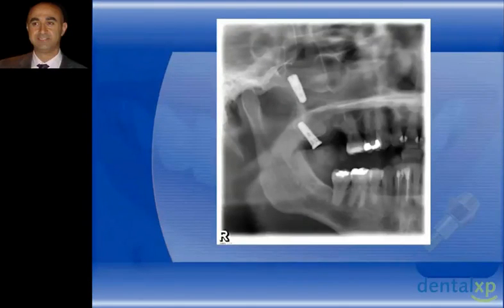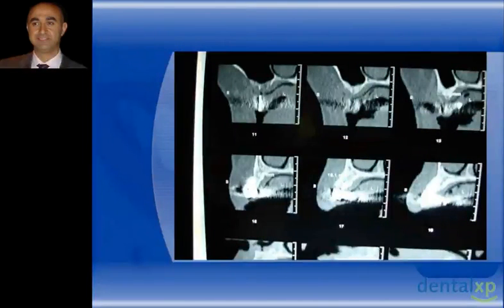It ended up, you can see, with the implant upside down inside the sinus, almost towards the orbit. In such cases I had to remove the implant from the sinus, replace bone and membrane, and place the implant again. It's very important, of course, in cases of sinus elevations to take CTs and use the new cone beam technology to plan properly the amount of bone that you have, from a buccal-palatal aspect and a mediolateral aspect.